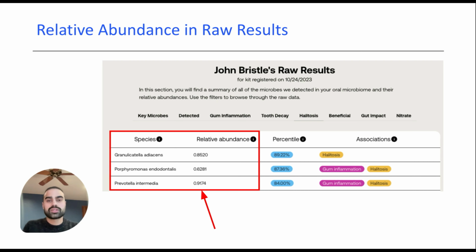However, the relative abundance is not always very helpful. Take, for example, the distribution of a species like P. gingivalis being somewhere between 0 to 0.3% across all patients. But then the distribution of a species like strep mutans being between 1 to 30%. If you saw P. gingivalis at 0.3% and strep mutans at 2%, you might think that the P. gingivalis is very low and the strep mutans is very high in this patient sample, when in fact the opposite is true.